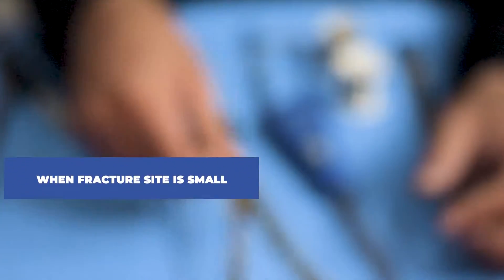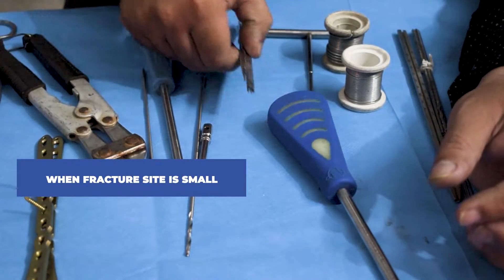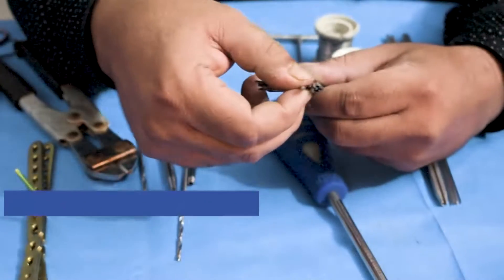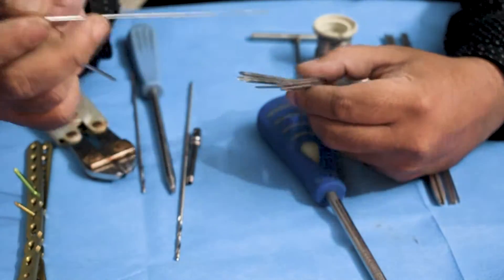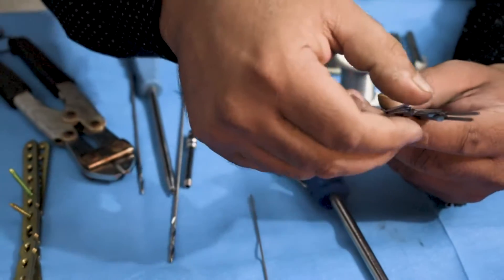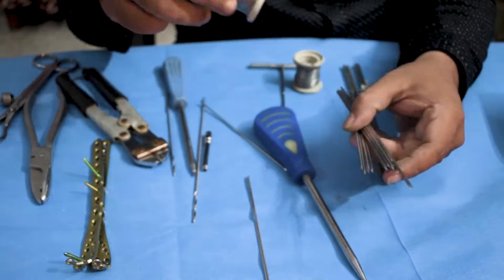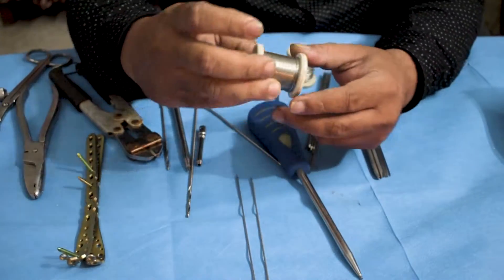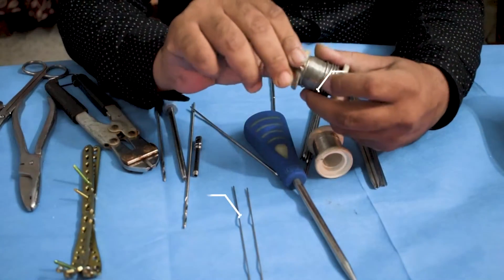At times when the fracture site is small and cannot be fixed by a plate, a K-wire is used for fixation of the fracture. The K-wire is used to hold the two fragments of the fracture together.